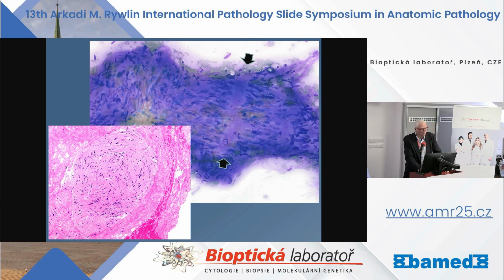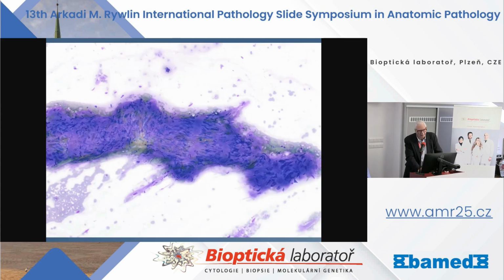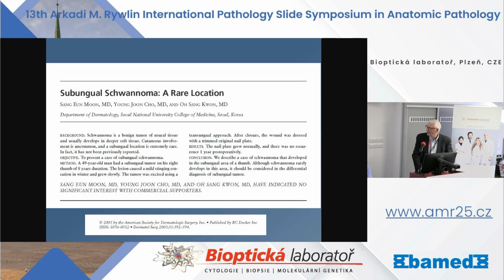So I called the surgeon back, actually back on this slide right here, and I said, you know, Joel, Dr. Marison, Joel Marison, I said, Joel, this looks like a schwannoma to me. He goes, a schwannoma, Paul, have you ever heard of a schwannoma of the thumb? I said, no, I never have, but after all these years, almost nothing surprises me. After we did that, I found this paper, subungual schwannoma. So apparently it does exist. I've never seen another case.